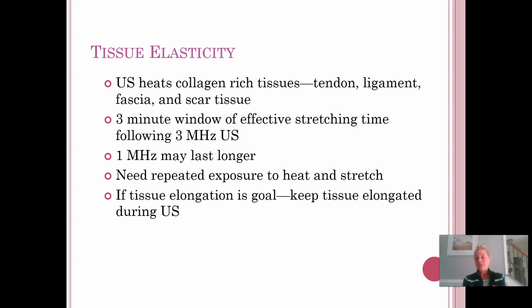It is believed that doing a deeper ultrasound at 1 megahertz may actually cause that heat to last a little bit longer. You do need repeated exposure to heat and stretch, right? We can't expect to do one ultrasound, stretch the person, and they're cured, right? We need to continue to do that. And if possible, and we're trying to elongate the tissue, if you can actually put the person in sort of a stretched position and elongate that tissue while you're doing the ultrasound, then that might be even more helpful because you're getting a stretch throughout the whole treatment as well.